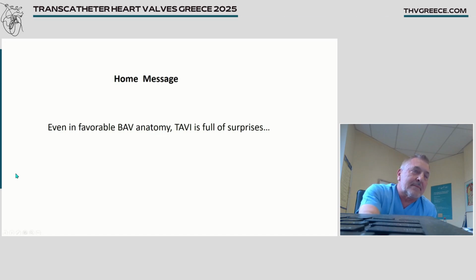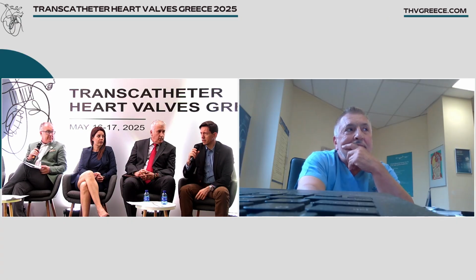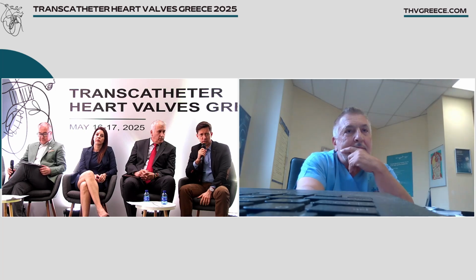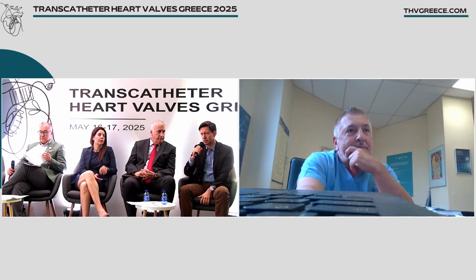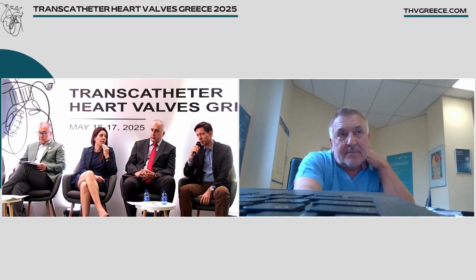Thank you very much, Dr. Tzifos. Very swiftly, we go to comments. Very nice case. It underlines the importance of measuring the intercommissural distance. Although it's less than 20% tapered anatomy, in such a case we would have considered a self-expandable valve.